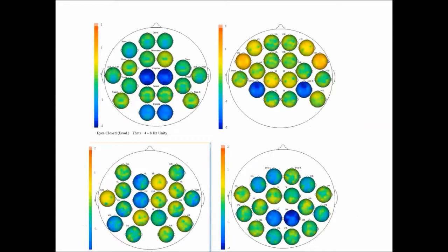Now this tells us which areas have instincts coming through, which areas are acting what we call functionally transparent. If it's orange, it's functionally transparent. It's supposed to be that the neocortex, as it's involved in an area, will start repurposing the subcortical impulses, and it will not be the same for all directions. They have different connections, different partnerships, in essence different wiring schemes. And so if you see orange, it's like everything's the same in all directions. That means the neocortex is just letting the subcortical impulses pass through, and not repurposing them for higher goal-directed thought. So it's very, very reactive to the environment.